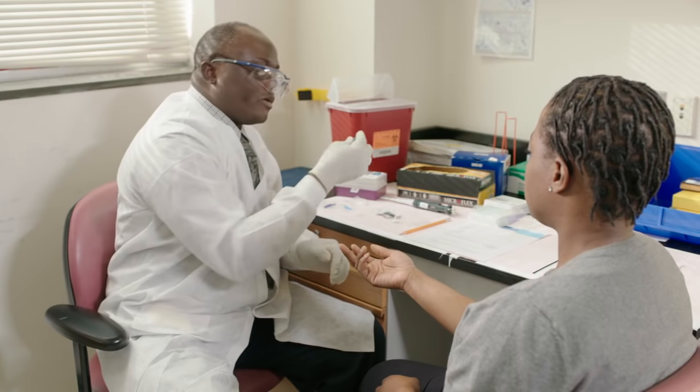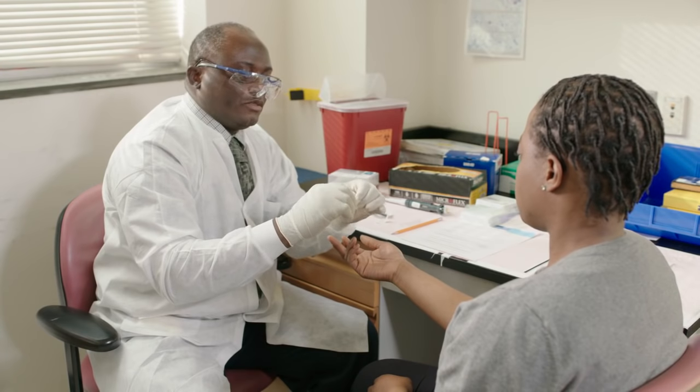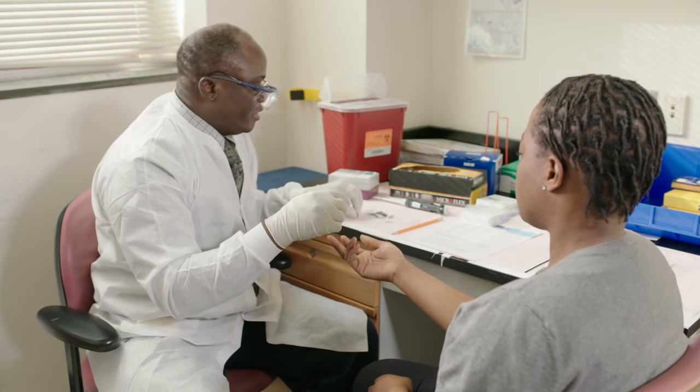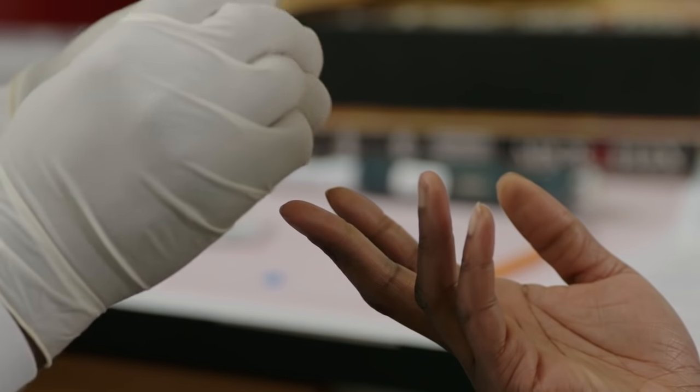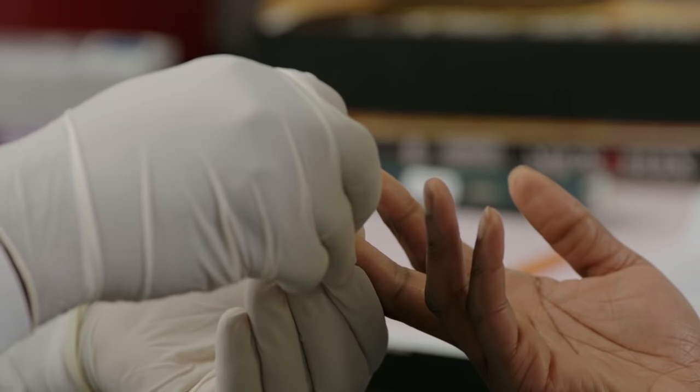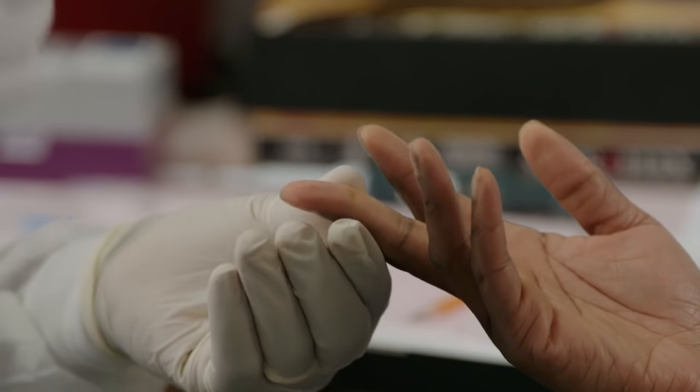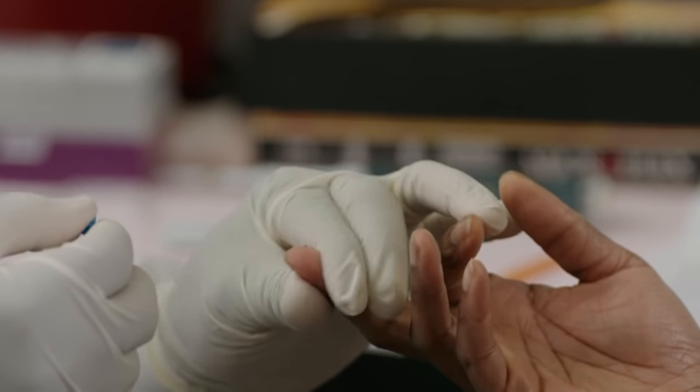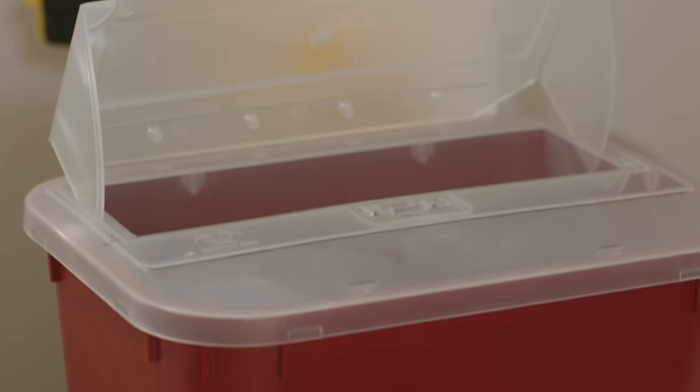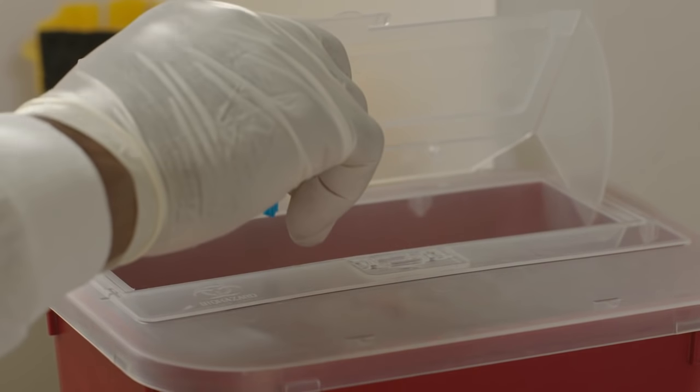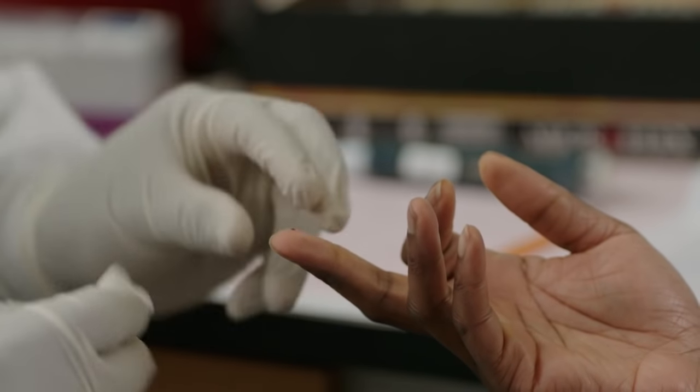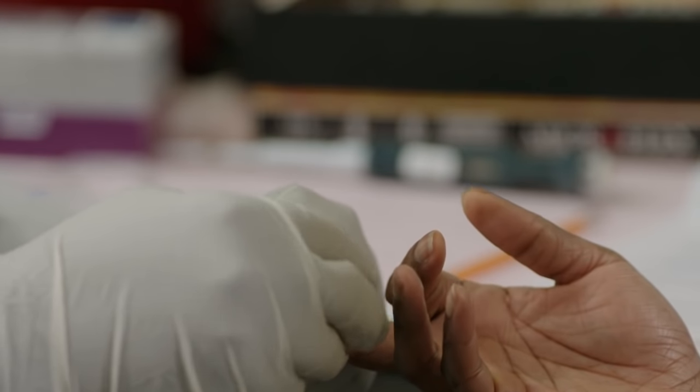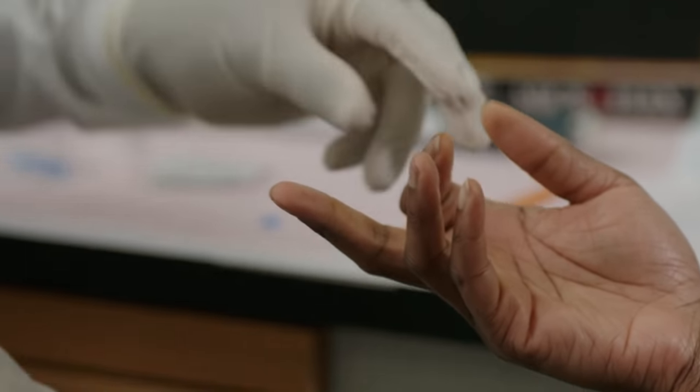So this is called a lancet. It's very sharp. I'm going to prick you so that I'll be able to collect the blood sample from you. Please make sure to dispose of the lancet in the biosafety box. I'll clean the first blood off with the tissue and then I squeeze it.